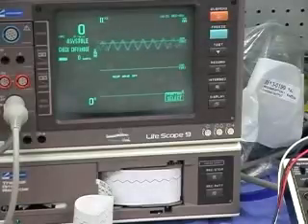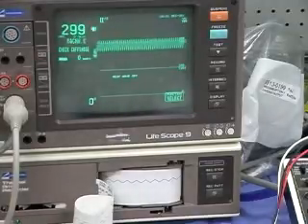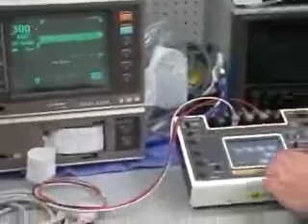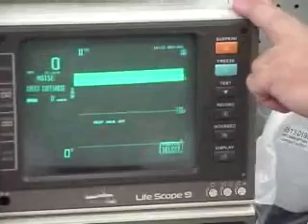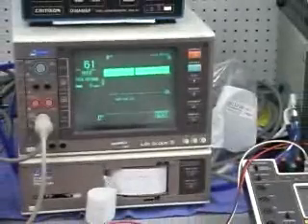Typically, you're looking at a 10 hertz sine wave, but you can also find out how this is set up for doing line frequency rejection. So we have a sine wave for 50 hertz. That looks pretty nasty. So undoubtedly this is set up for a 60 hertz system. And we turn on 60 hertz. That's pretty nasty too.